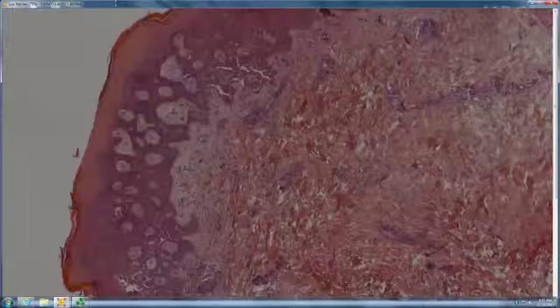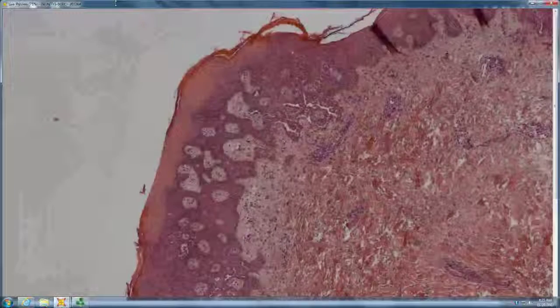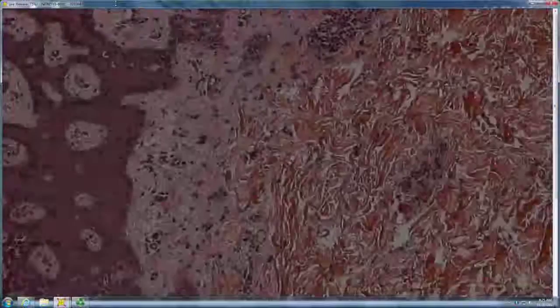You need the clinical to know what it is. In acrokeratosis verruciformis and Darier's, do you see any acantholysis, or is this more of a warty? You can occasionally. So acrokeratosis verruciformis will show occasional corps ronds. Other times it just looks kind of like a wart without a whole lot of hypergranulosis. Certainly no koilocytosis. Another acantholytic type process going on here.